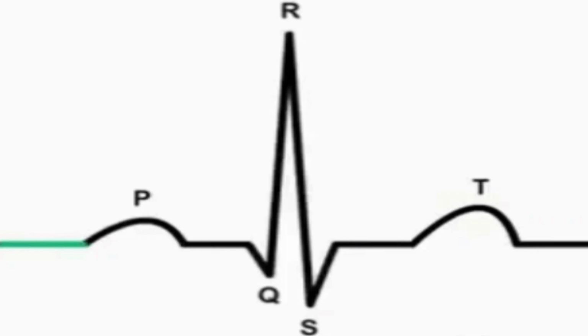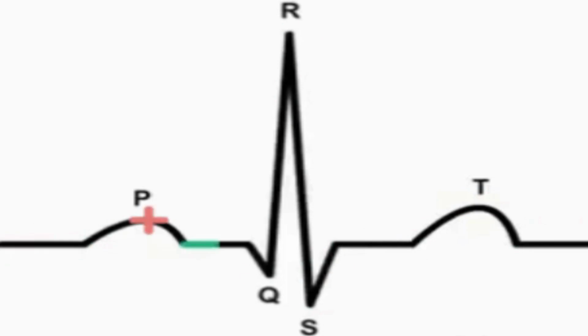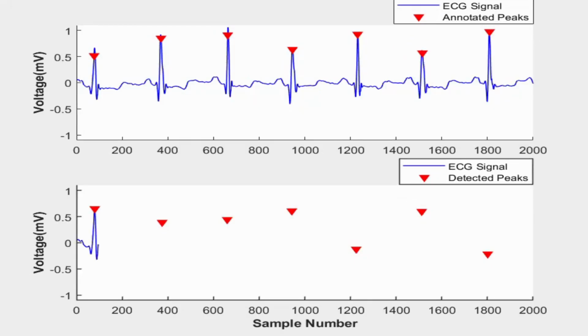Different ECG peaks play a very important role in cardiac arrhythmia diagnosis. Accurate detection of these peaks helps in automatic heartbeat classification. The more accurate the detection, the more accurate will be the diagnosis. P and T peaks are detected using the fusion algorithm based on 2 event-related moving averages and fractional Fourier transform.